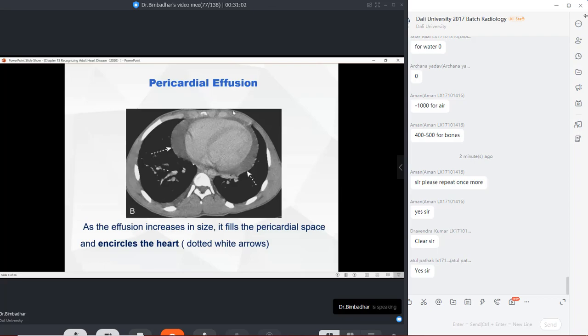But let me ask you a question. If this had been blood rather than a fluid, how would the density be? If this place had filled up with blood, how would this look?